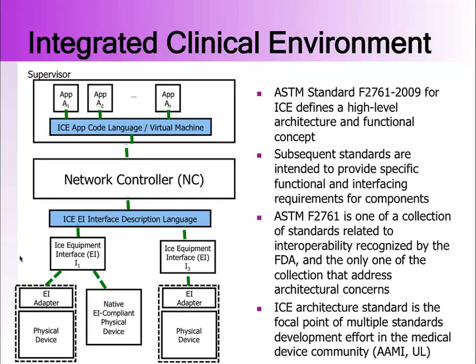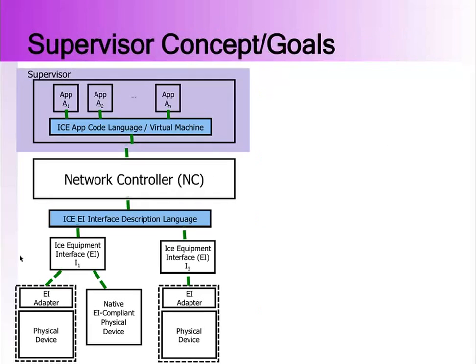So this is an ASTM standard. It just specifies essentially the blocks in this architecture without defining the details of their interfaces. But this standard is the focal point of multiple subsequent standard activities, and it's the only such standard that's recognized by the FDA at the moment. So that's one of the reasons that we're working with it.